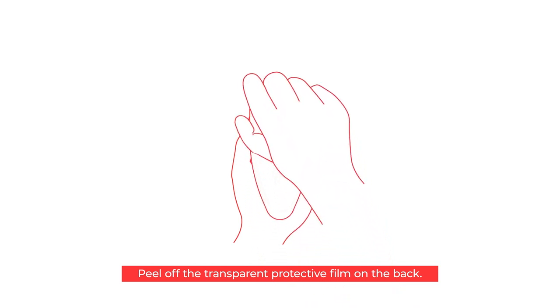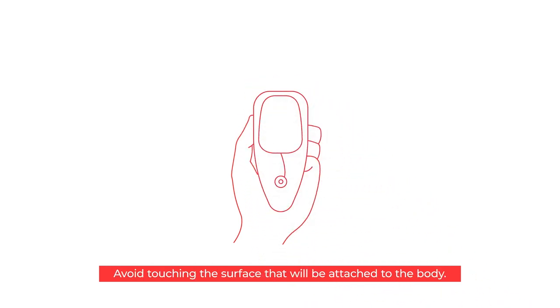Peel off the transparent protective film on the back. Avoid touching the surface that will be attached to the body.